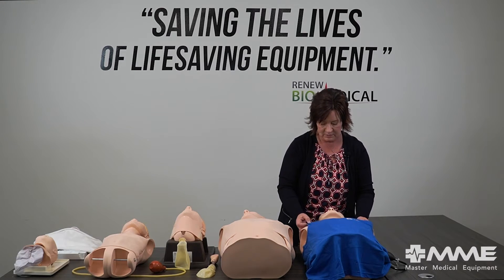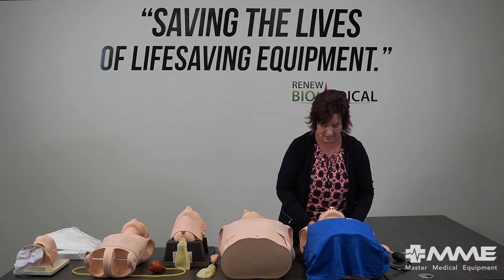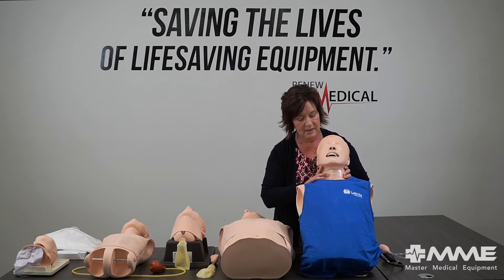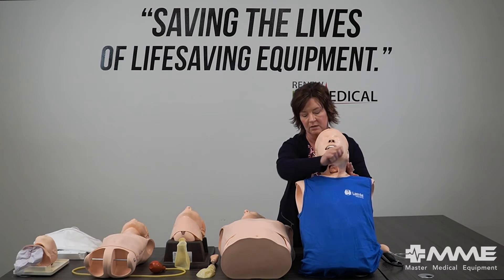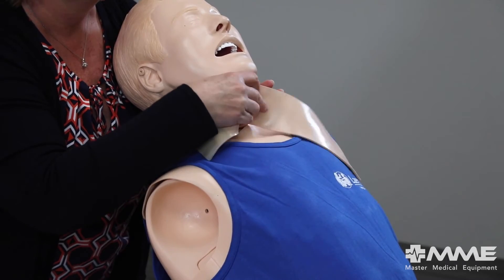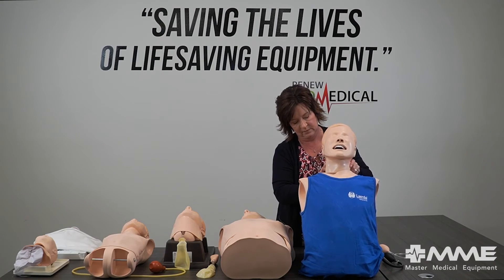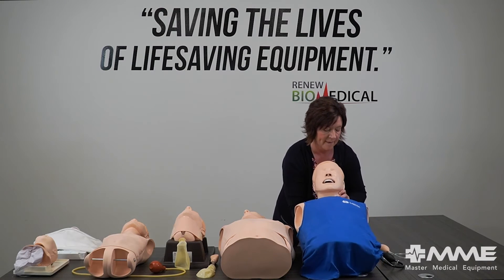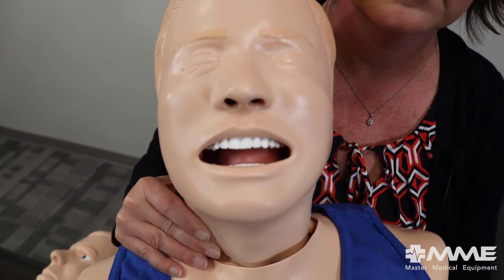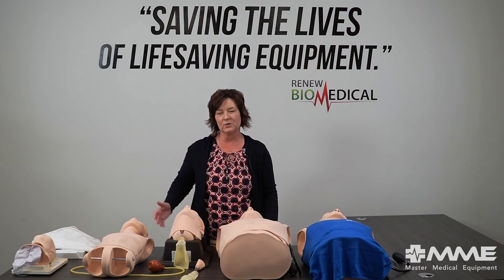Now we're going to come to our deluxe adult airway management system. He's built out to do a few different things: he has carotid pulses with a bulb just like our junior does, you can use any oral or nasopharyngeal device on him, and he also has the ability to do a surgical or needle crike. You'll want to replace that orange high tape after your procedure, and the next skin goes around that to allow you to perform the crike. He also has the ability to inflate his tongue with this ball — a couple of presses and you can really see that tongue inflate.